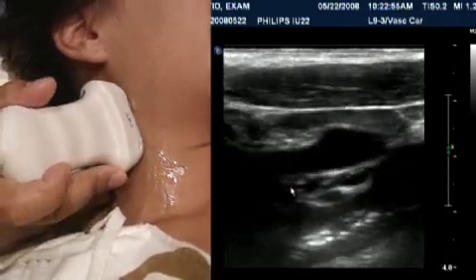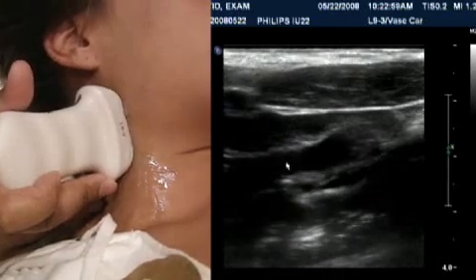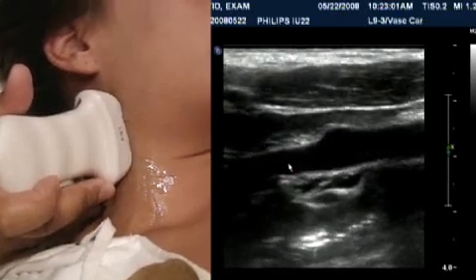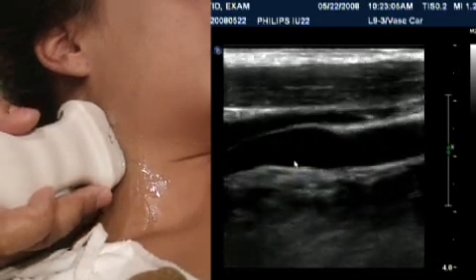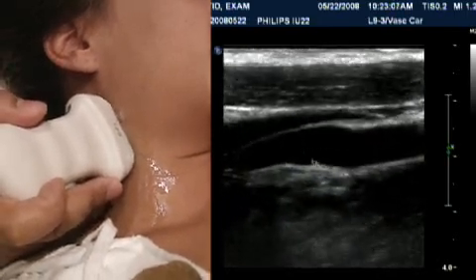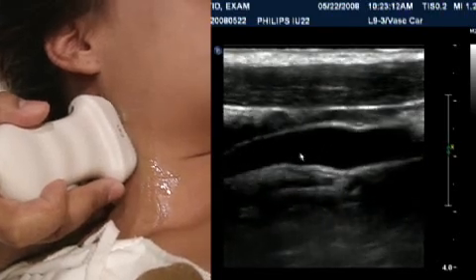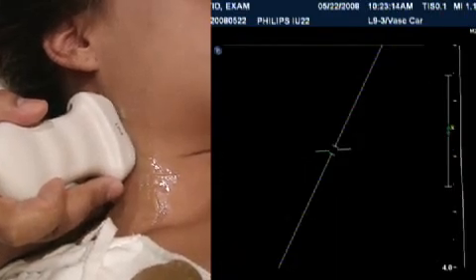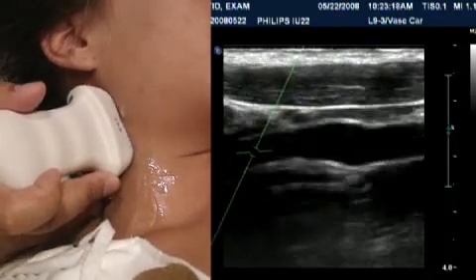Now I'm pointing the transducer toward the face. This is the second vessel. My guess, based on anatomic location and transducer position, is toward the face external, away from the face, and because of the larger size and the location of the bulb, internal. But you really should confirm that by placing a sample volume in the vessel and just taking a quick look at the Doppler spectral waveform.